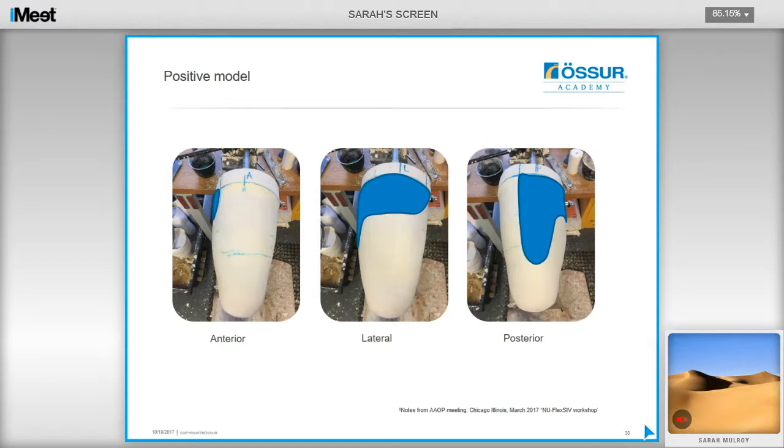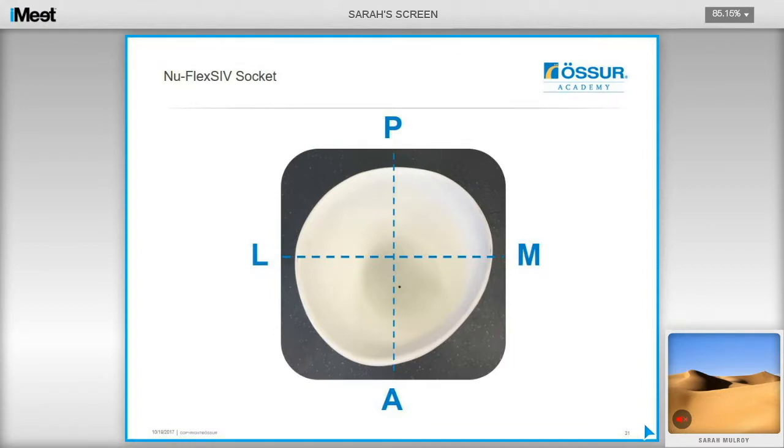The photographs show modifications focused on the proximal, posterior, and lateral quadrants of the positive model. Ensure that reductions are mainly made in these areas before cleaning up the cast to your overall measures. It is a simple modification — be accurate with your percentage reductions and you will end up with a result that is very close. The definitive socket has equal amounts of material removed from the posterior and lateral sides, creating a quite cylindrical socket shape.